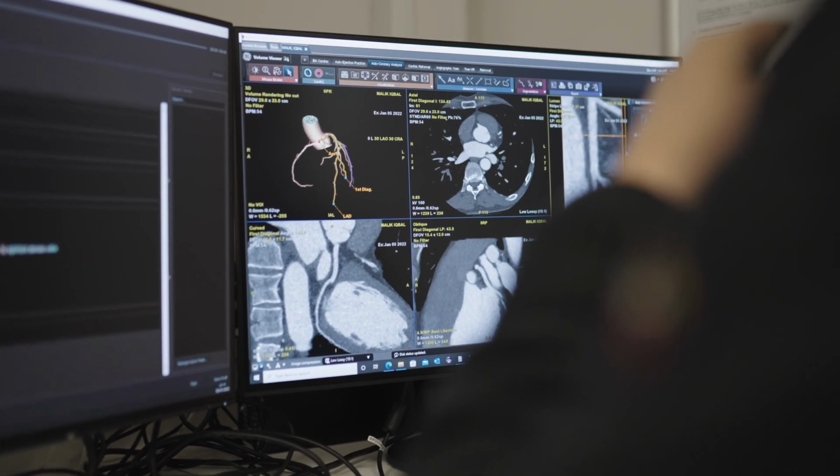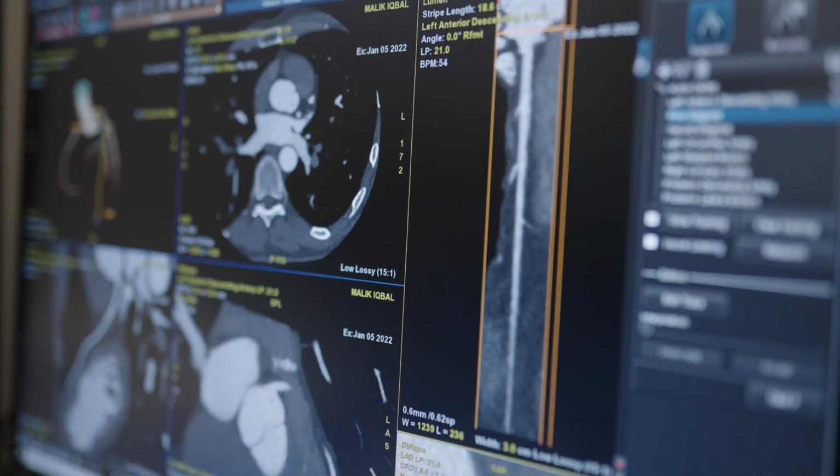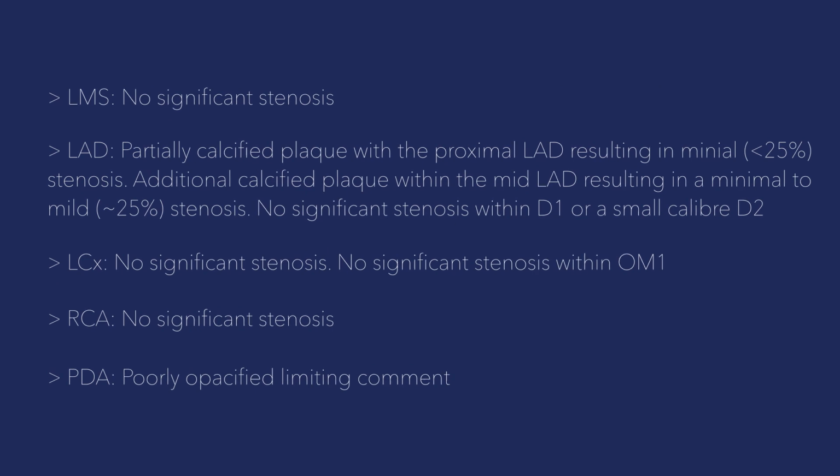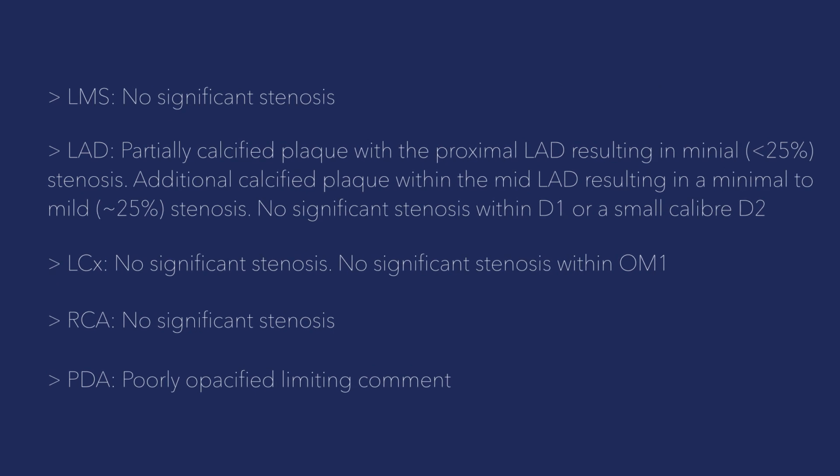The other part of the scan is looking at the anatomy of the blood vessels. Are they open? Are they closed? And thankfully, the most narrow they become is about 25%. That is not quite as good as 0. I was hoping for 0, but actually you're not going to get any symptoms from those narrowings until they're at least 70 or 80% narrowed. So I'm far away from that.